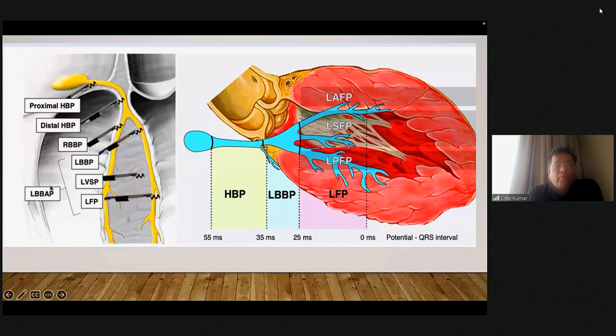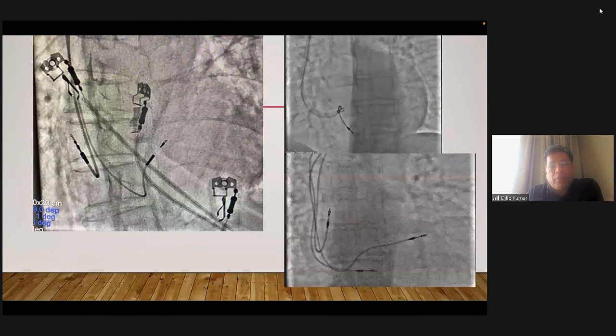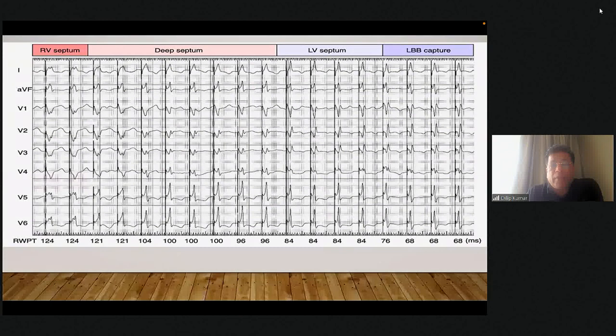So let's now come to conduction system pacing. We are all aware that if you engage the conduction system, whichever way you do it, whether stylus driven or with a lumenless lead, and you hit the right spot, you get a very narrow, almost normal looking QRS. There will be zero pacing-induced desynchrony, and that is what gives you the final edge and the benefit.